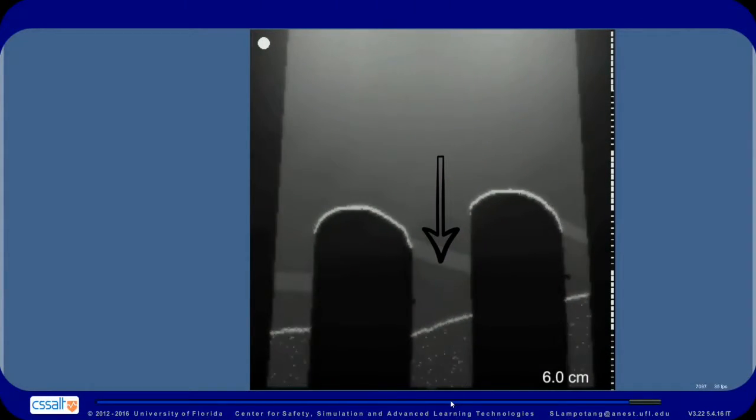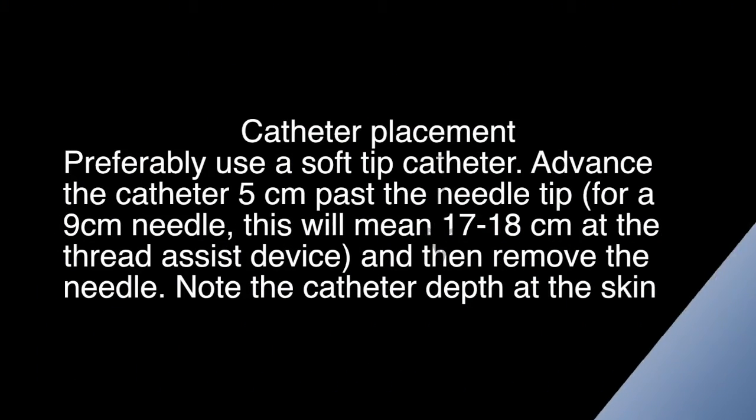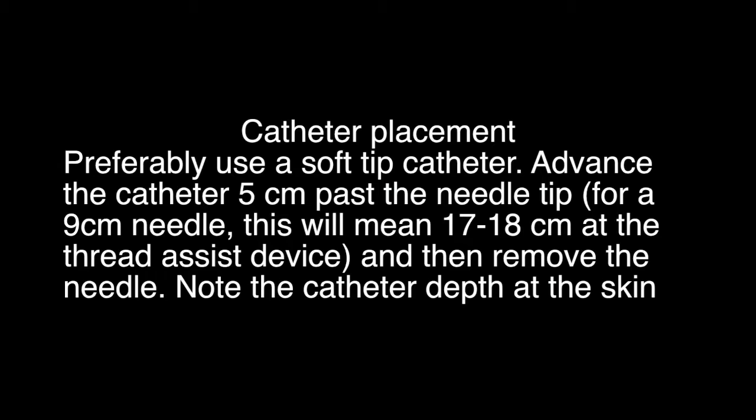Here is an ultrasound verification during injection of normal saline. As you can see, hydrolocation is in play here. Preferably use a soft tip catheter. Advance the catheter five centimeters past the needle tip — for a 9 centimeter needle, this will mean 17 to 18 centimeters at the thread assist device. Then remove the needle and note the catheter depth at the skin.